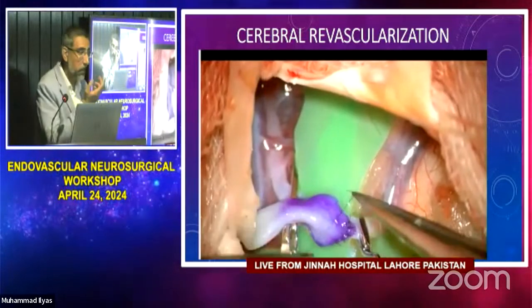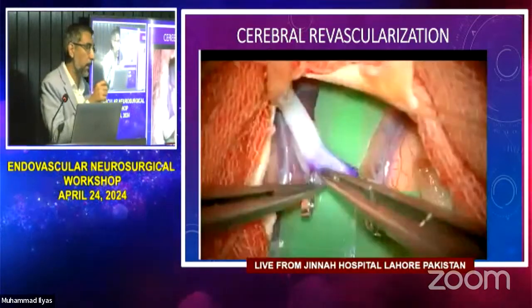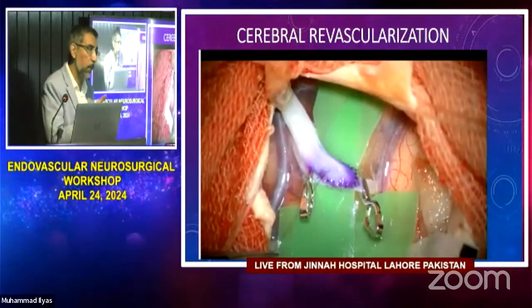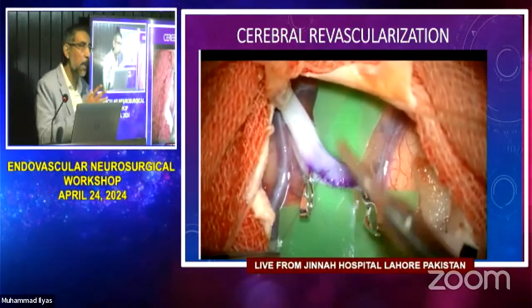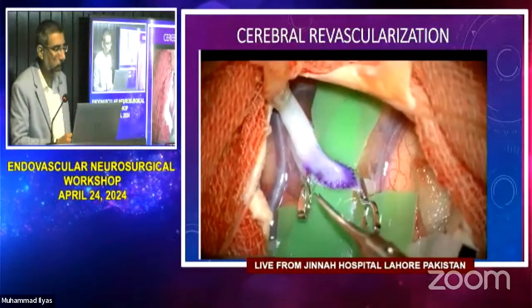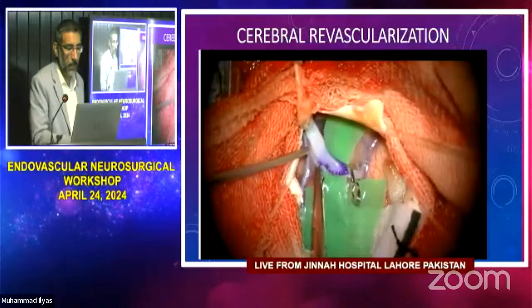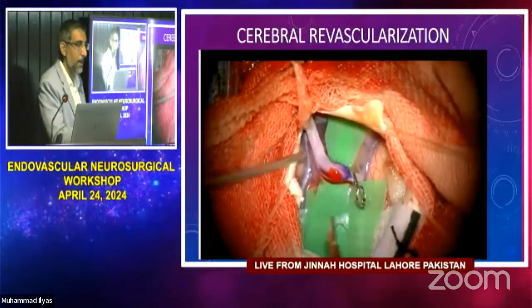And then even sometimes you can do the best of job, but sometimes if you accidentally grab an extra layer, it will occlude your aneurysms, occlude your bypass. So you have to open the whole thing again and then redo it. So it's painstaking. It's basically only putting a stitch and tying it, which you guys have done millions of times, but it's just done on a much smaller scale.